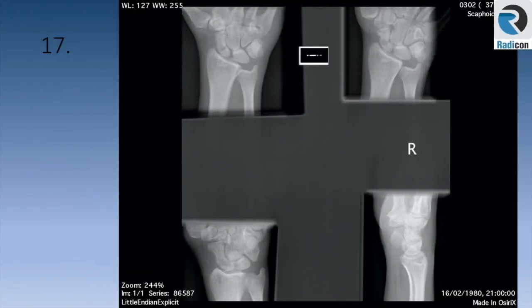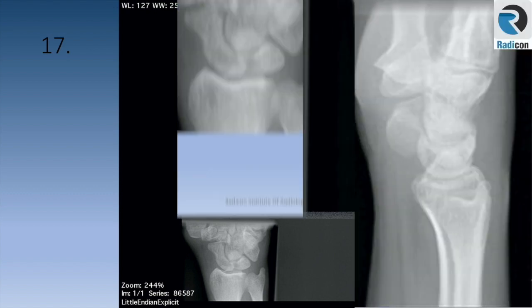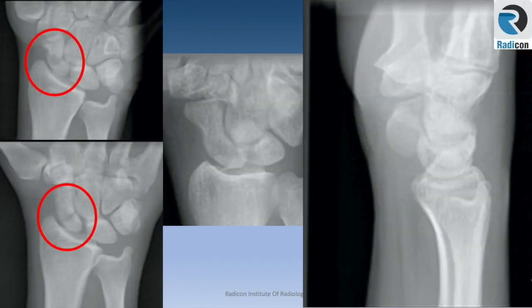Case 17. Here is the scaphoid series. Take your time and zoom up the images one by one. It is pretty easy to see the scaphoid fracture — a classic for a rapid reporting pile.